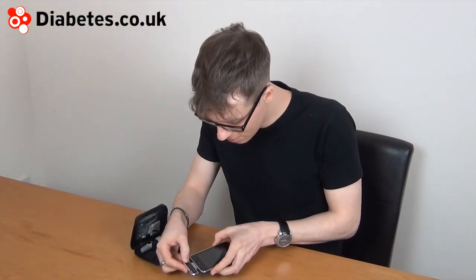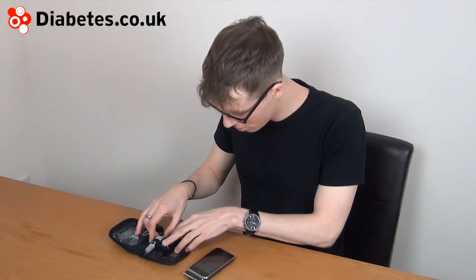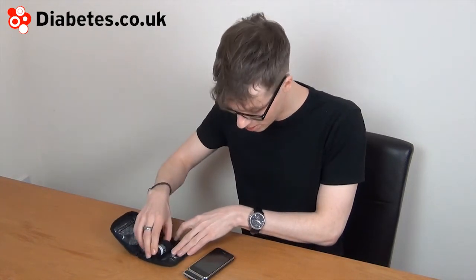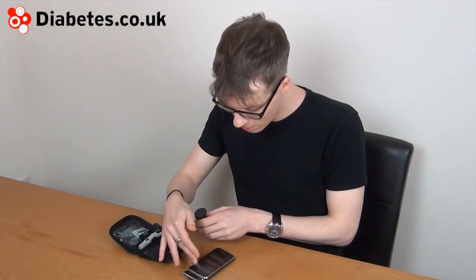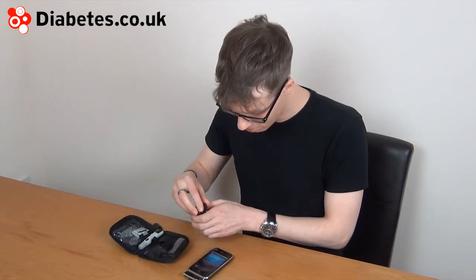You can do a test with the meter attached to the iPhone or iPod, or with it unattached. If it's unattached, it will automatically download the readings the next time it's plugged into your iPhone.